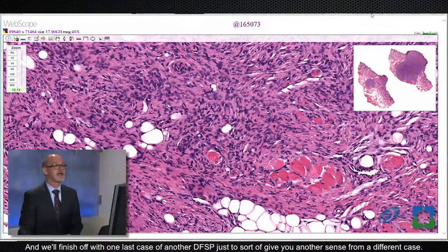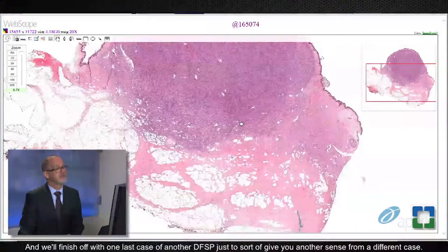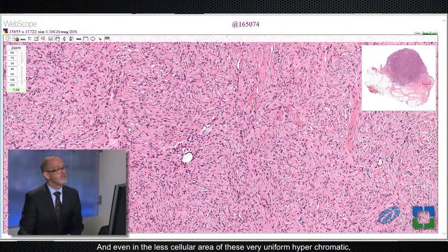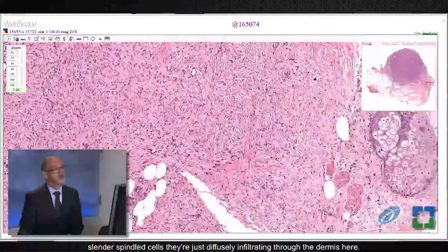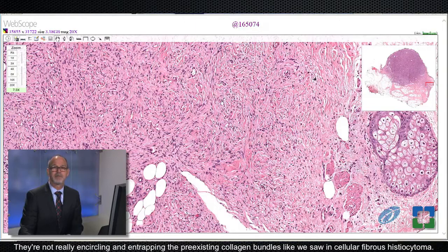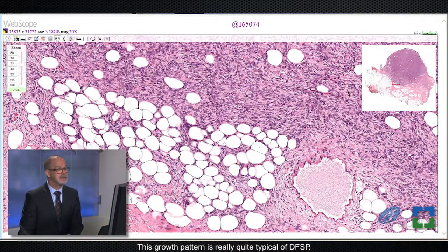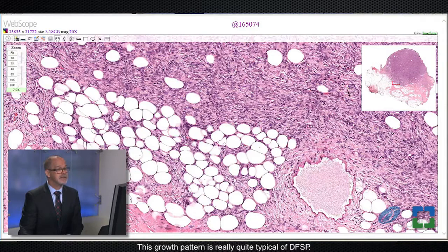We'll finish with one last case of DFSP to give you another sense from a different case. Here we have a slightly less cellular area and a slightly more cellular area of this DFSP. Even in the less cellular area, these very uniform, hyperchromatic, slender spindled cells are just diffusely infiltrating through the dermis — they're not really encircling and entrapping the pre-existing collagen bundles like we saw in cellular fibrous histiocytoma. And as we go into the deeper aspect of the tumor, it really diffusely infiltrates through the fat and percolates through and around these adipocytes. This growth pattern is really quite typical of DFSP. Thank you for your attention. I hope you found these cases interesting and we look forward to hearing from you.